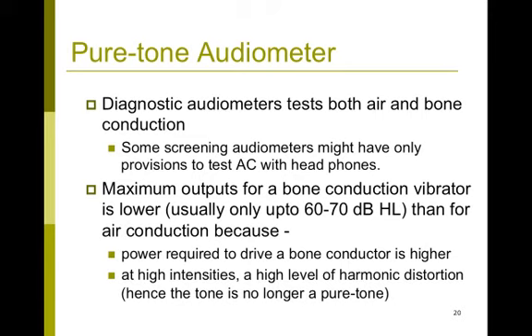As I said, diagnostic audiometers enable us to test both air and bone conduction. Some screening portable audiometers might have only the facility to do air conduction testing with headphones. Those screening audiometers are used to determine whether this person has normal hearing or not. And if they fail the screening, they are referred for a diagnostic pure tone audiometry to accurately quantify and diagnose the type of hearing loss.